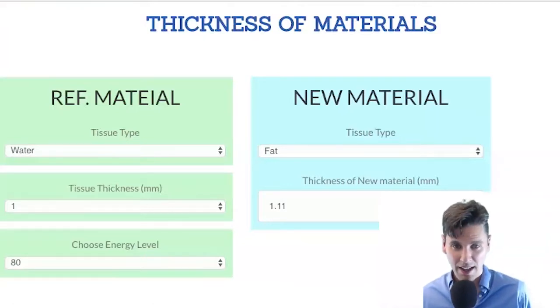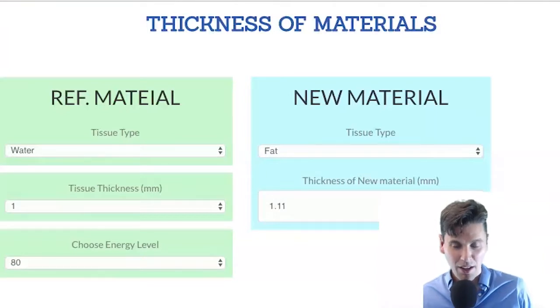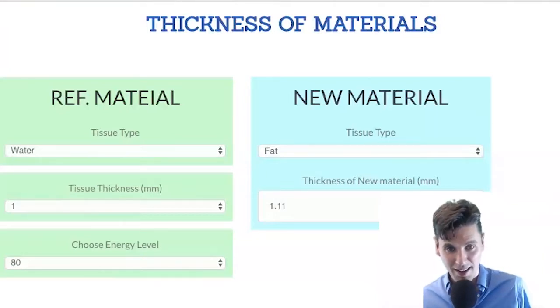The idea is, say I live in Detroit, where I grew up, and I want to move to the Bay Area. How much more money would I need to get a job and have an equal standard of living going from city A, Detroit, to city B, San Francisco? You can go to these little online calculators. So this was the same idea, except for X-ray transmission instead.